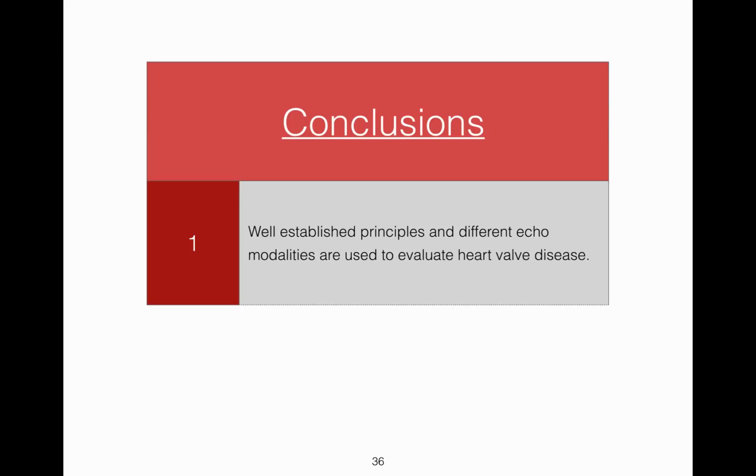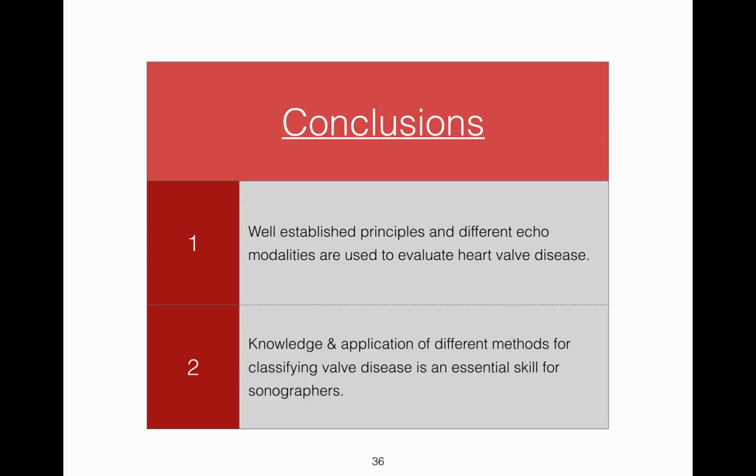So, in conclusion, well-established principles and different echocardiographic modalities are used to evaluate the various forms and degrees of heart valve disease. Knowledge of and application of different methods for classifying valve disease, and the knowledge of the different positive and negative aspects of the measurement, are essential skills for cardiac sonographers.